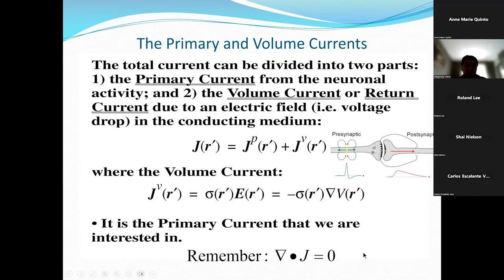And so in the brain, last time I mentioned there's a neuronal current, that's the current of our interest. But I mentioned MEG is insensitive to the action potential, the green one, because of the cancellation left and right, up and down, right? So MEG, like other functional imaging technologies, fMRI, PET, EEG, is insensitive to what happens in the white matter. We're all sensitive to what happens in the gray matter. And we're particularly interested in the yellow and red, the postsynaptic current or potential.